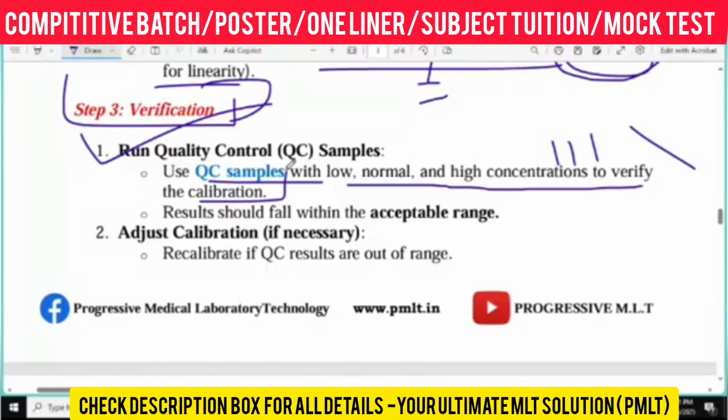Whatever question they have already understood, whatever concept they have already understood, after that we are taking the test for checking their knowledge. That is also like that. Whatever teaching we have already done to the instrument, and whatever calibrator we have already learned, we have to check, as well as take the examination of the machines by running the quality control, so that whenever we run the quality control we will get the result.